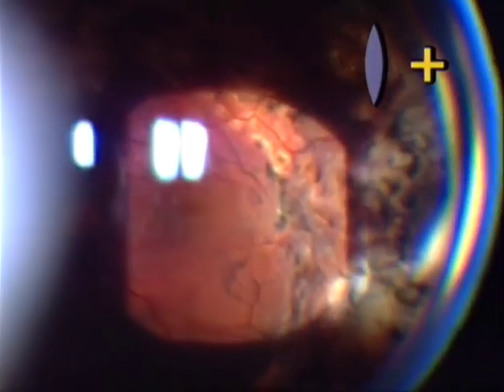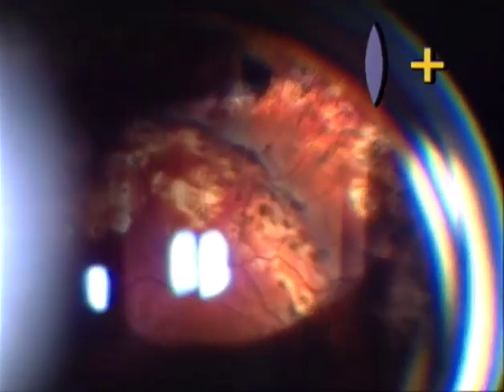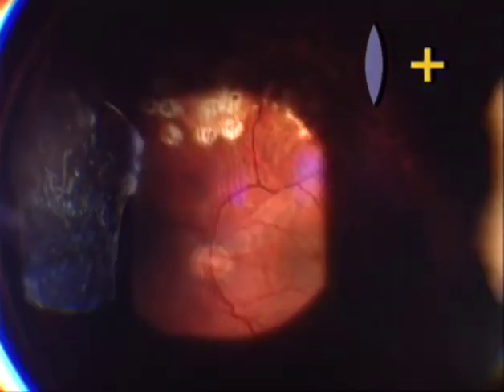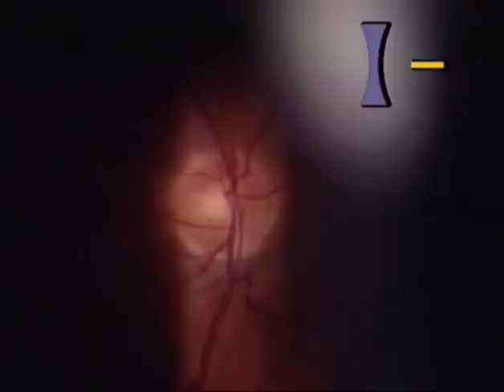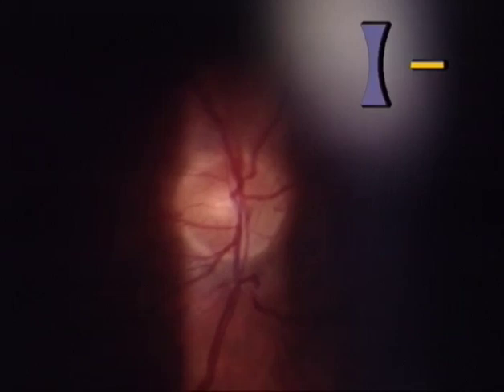Seen with a plus lens, this case of retinal surgery with an encircling band can be scanned beyond the equator. The high-power plus lens provides a wide field of observation similar to indirect ophthalmoscopy. But note, the magnification is low and the image is inverted. A minus lens, in contrast, provides results rather similar to direct ophthalmoscopy. Here, in the same case of retinal detachment surgery, the image is straight, the magnification is higher, and one can see more details, such as these fine retinal folds. The field of observation, however, is smaller with the minus lens currently used.